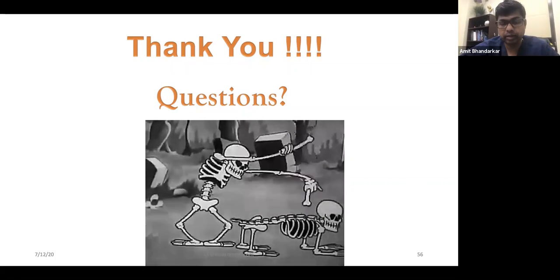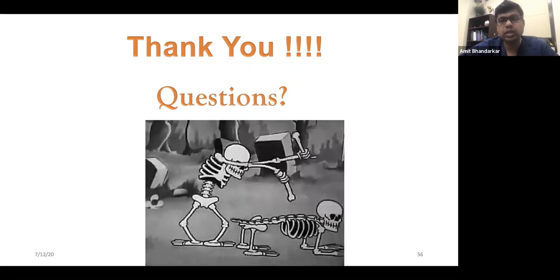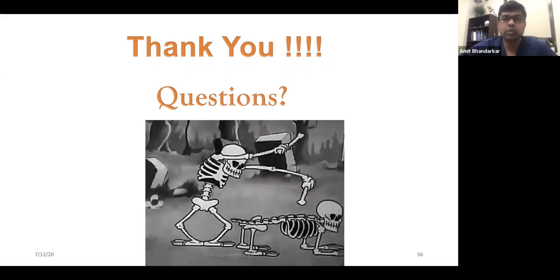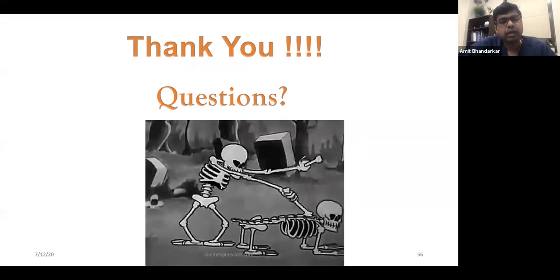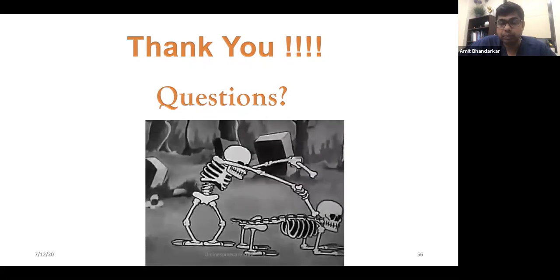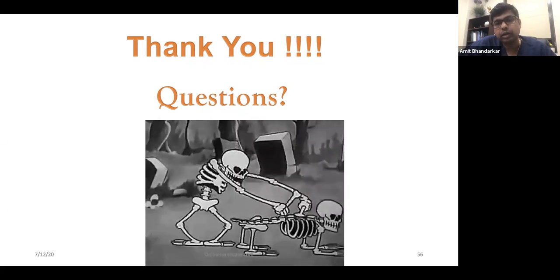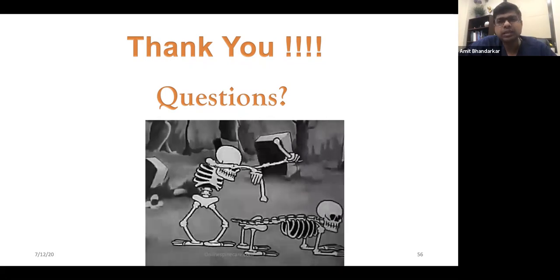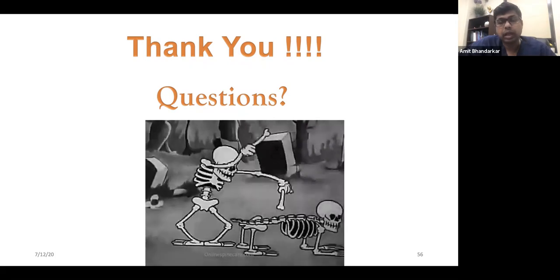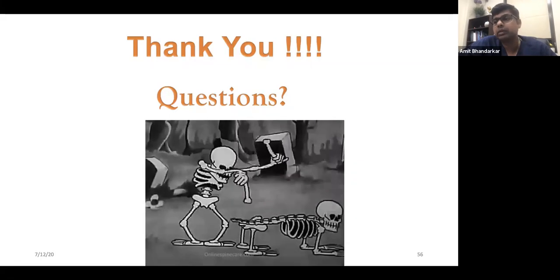Anything for which a fusion is indicated. Cage insertion is a part of fusion. So we are optimizing fusion. For anything for which a fusion is needed, I think a cage is always an option. So it's not about indication for a cage, it's the indication for fusion. From a postgraduate perspective, a particular patient has spondylolisthesis, a mobile spondylolisthesis, or the patient has severe discogenic pain and has exhausted all the conservative options, or the patient has compression of the exiting foramen from the decreased disc height and needs a disc height restoration. These are some of the indications for fusion too. So when the fusion is decided, then the cage becomes a good option. I'm not saying that the posterolateral fusion does not work, okay, but the cage optimizes a lot of things a fusion can achieve.